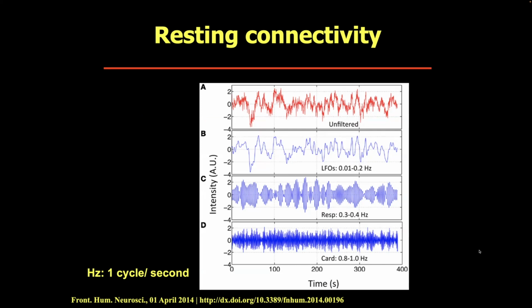And then you look at blood flow that's going to some parts of the brain because they are aligned with the task, compared to some baseline. In this case, there's no task. It's just the individual lying quietly in the scanner, not sleeping, and you turn on the scanner and begin collecting data. And the A here is just the BOLD signal that you've seen several times in these slides.